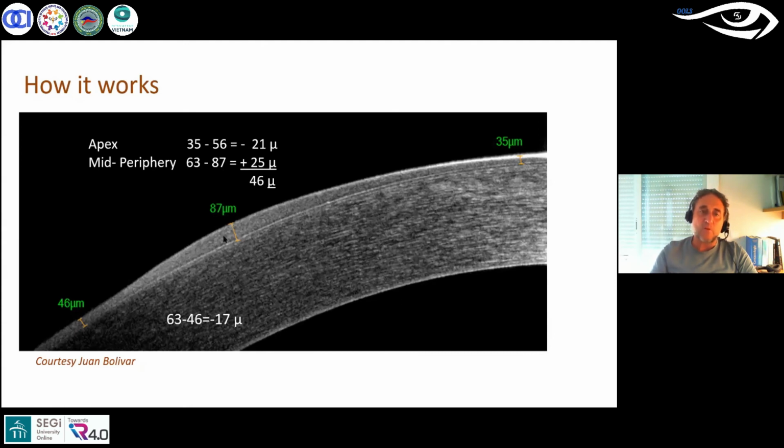This is a plus power area. This is a curved, more steepened radius of curvature, and this means this is a high increase in plus power. That's why we talk about the plus power ring or the changes in peripheral refraction.